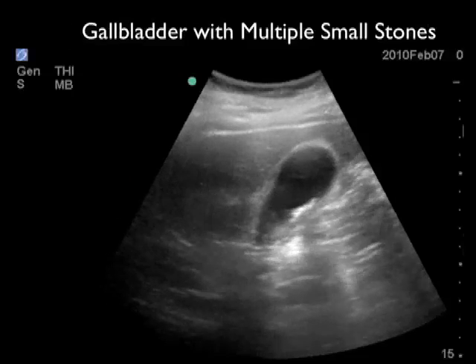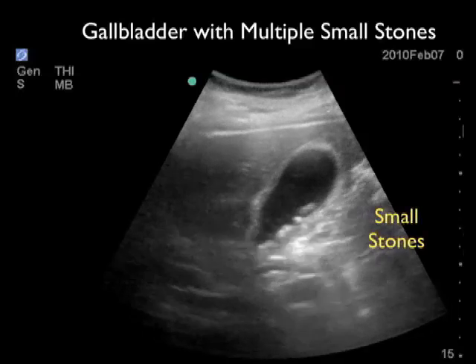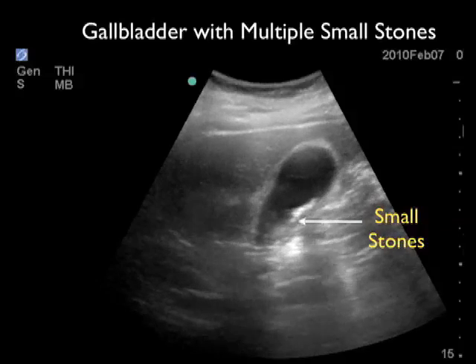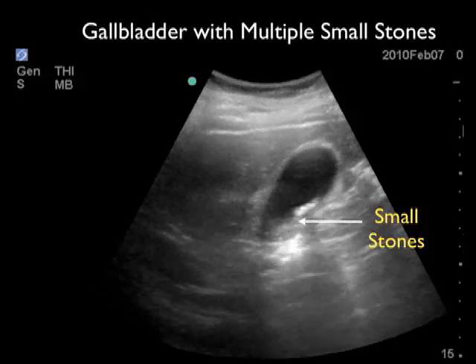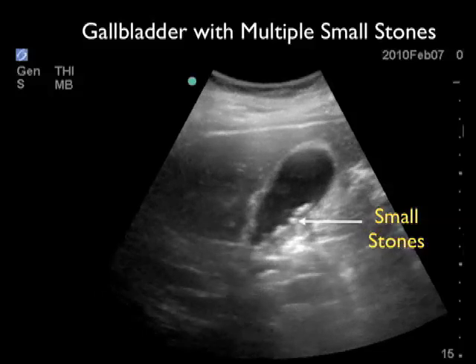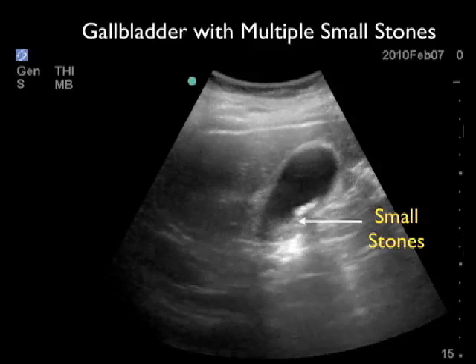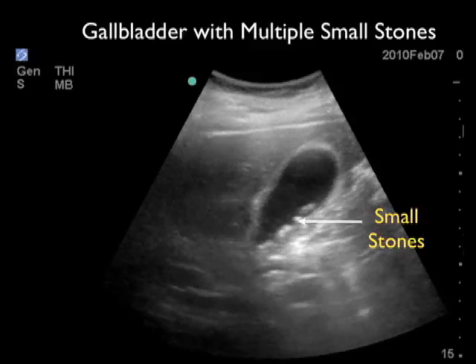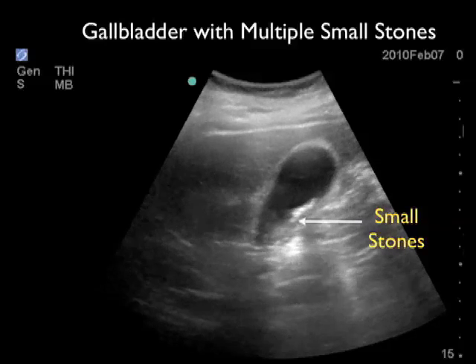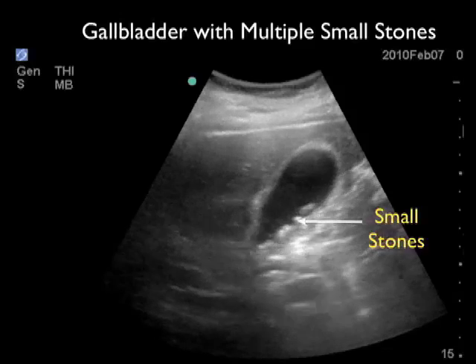Here's another video clip, again from a male presenting with right upper quadrant pain. We see the gallbladder in the middle of the image, and notice the layering of multiple small stones on the back wall of the gallbladder. We see the characteristic appearance of a gallstone — it has a hyperechoic or bright appearance, and we can see shadows coming off the back as the sound waves can't permeate the hard cholesterol crystals.